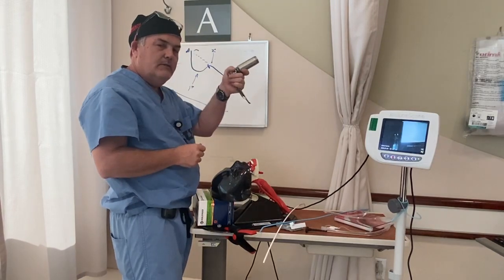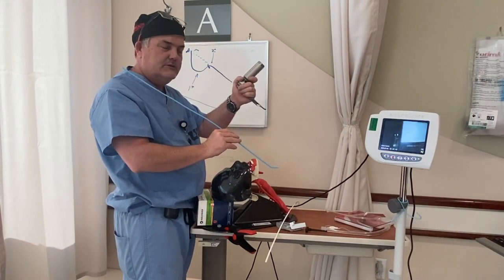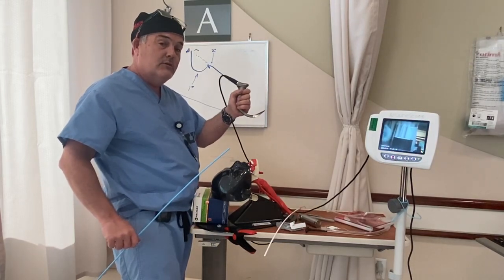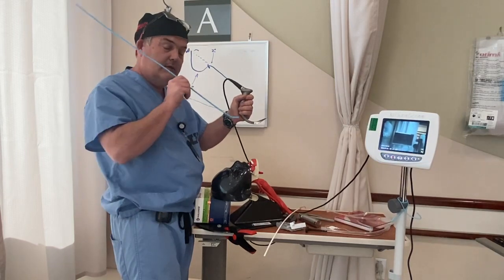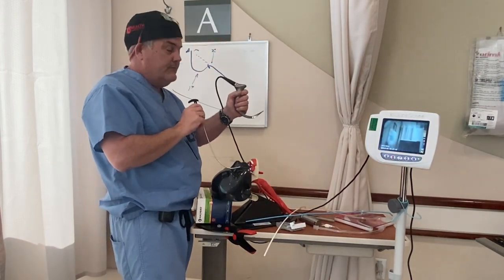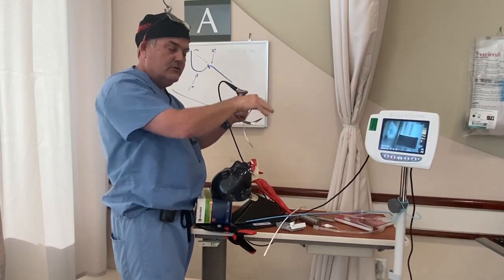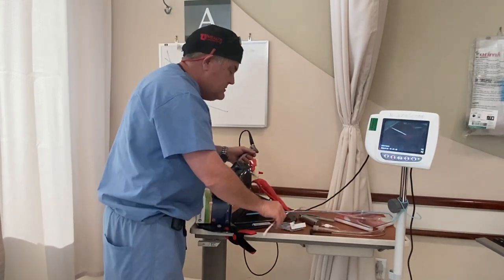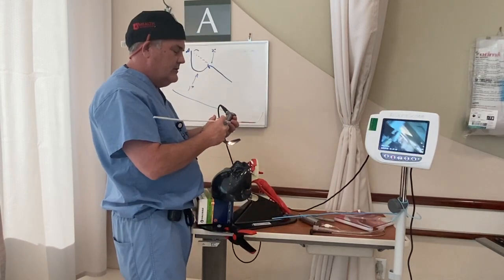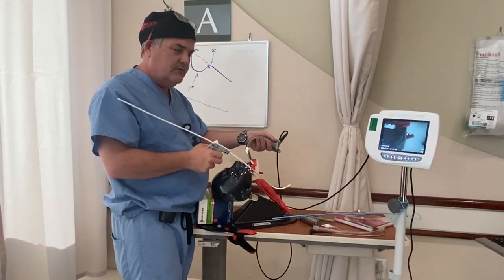First: direct laryngoscopy — flatten the primary curve, reduce the inflection point, tracheal access with a linear bougie. Second: hyperangulated blade that looks around the primary curve with the serpentine pathway intact; linear bougie goes right down the esophagus, rescue with an anterior curved stylet that brings the tip to the cords, then force and rotation uses the anterior trachea to turn the corner. Third: dynamic introducer that allows both anterior and posterior steering, working around a serpentine pathway with very little force to tissue.